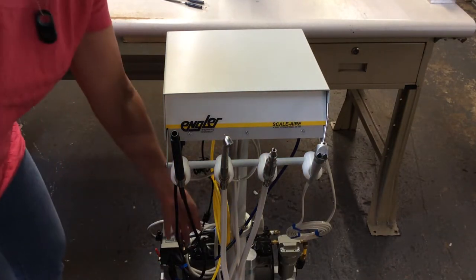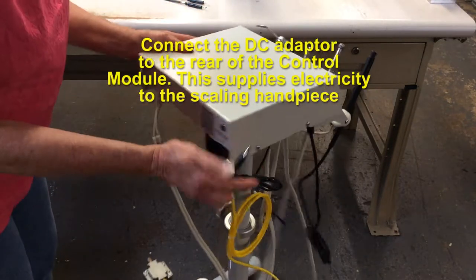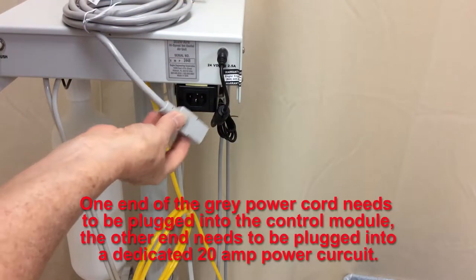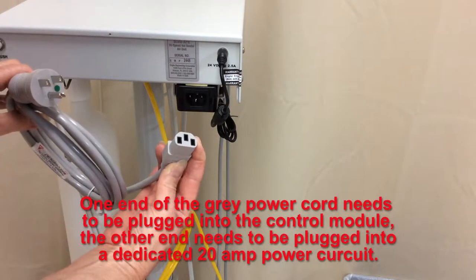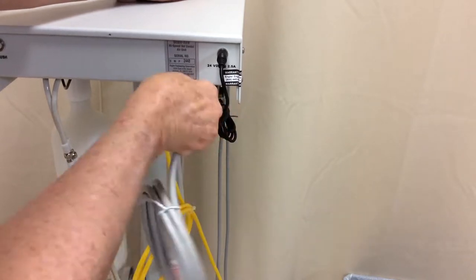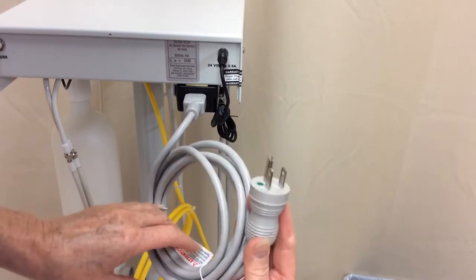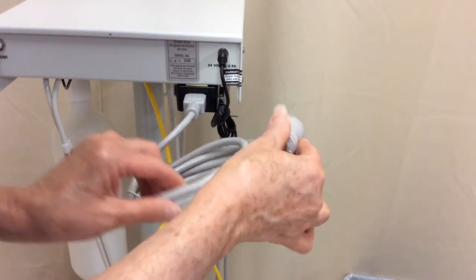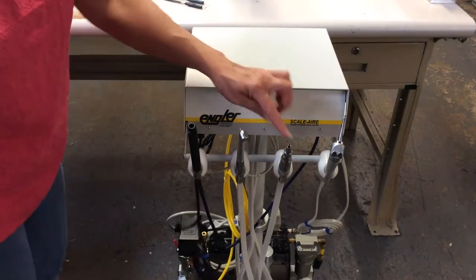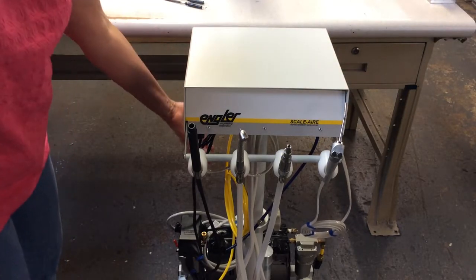The DC power plug supplies power to the scaler — plug it in the back. The gray power cord connects to the back of the unit; make sure it is all the way plugged in, and then the other end goes into the wall plug. The high speed, low speed, and syringe are powered by air coming from the compressor.